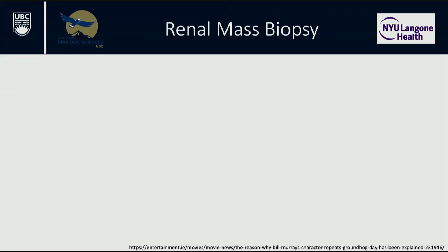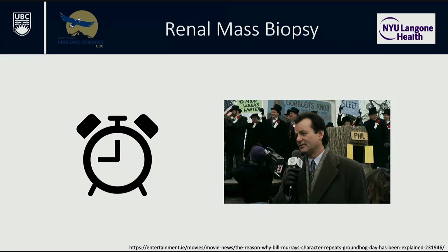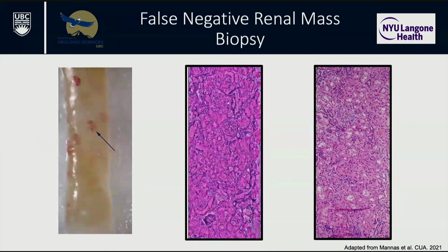Well, I had a little extra time, and so I started looking at renal biopsies as well. I started looking at ex vivo renal biopsies. And I think everyone here knows if you do a renal biopsy, a lot of them come out non-diagnostic. In the literature, the rate is only about 25%, though in some patients it can be up to 45% if it's a difficult biopsy. So once again, it's like Groundhog Day. What do we do? Well, we can just take it out or we can watch it. So this was the first kind of assessment I did.